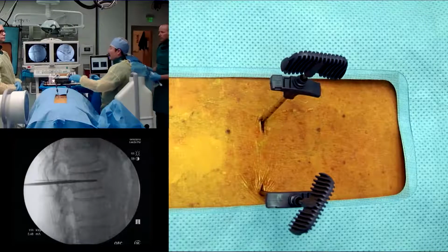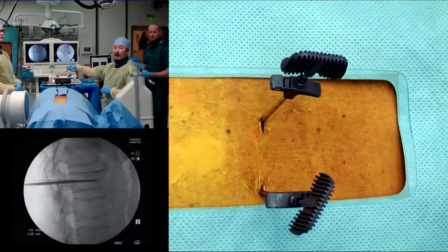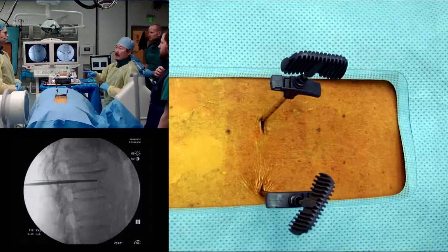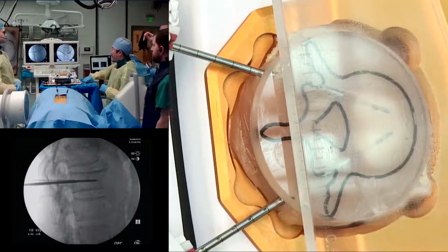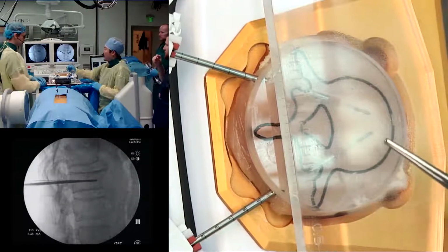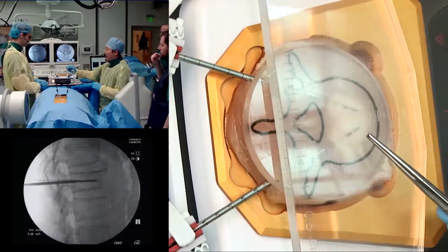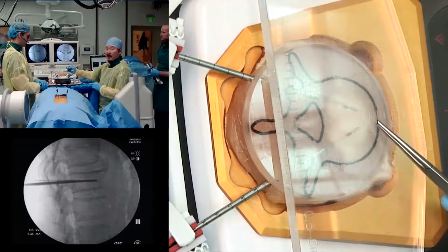Is there a way to actually get the video here? So essentially, if you have a tumor burden within the vertebral body, it allows you to use the RF to actually heat the area, so you can use heat to kill some of the tumor cells.